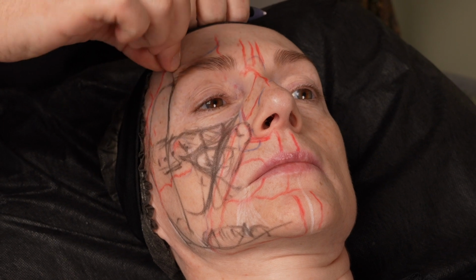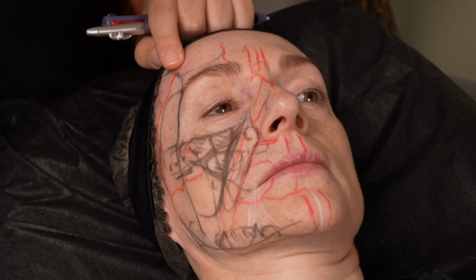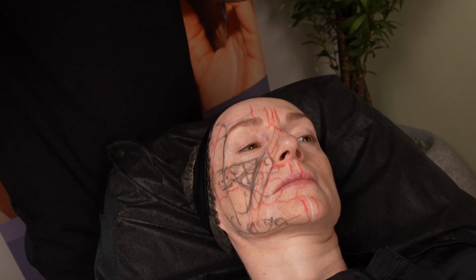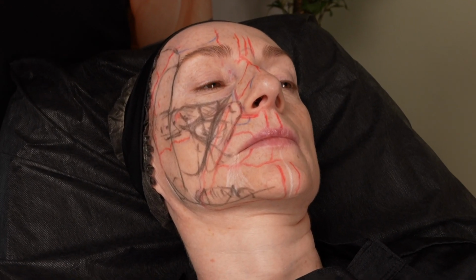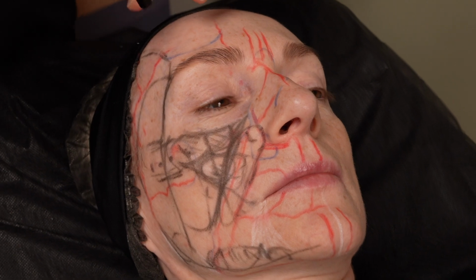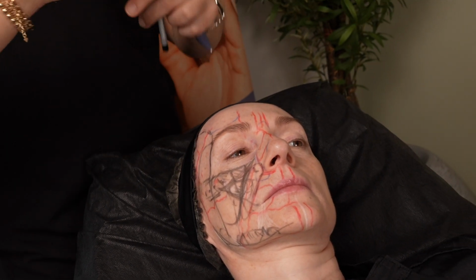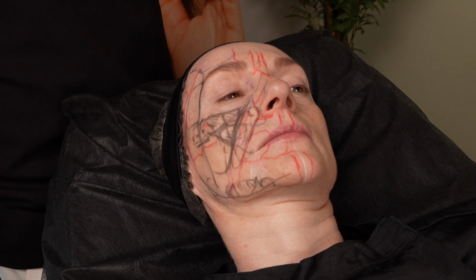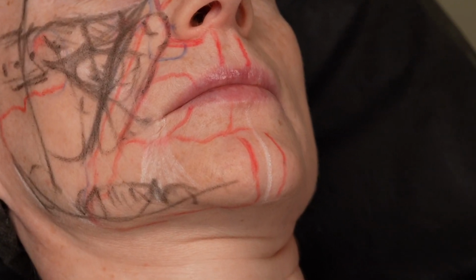If in the crest area I open with my guide needle until the bone, until the galea, then I put my cannula until the galea, then I slide to the temple area. I open, touch the bone, then I slide to the temple area, I'm over the galea, then my cannula is directly over the deep fascia. It means interfascial layer. Okay, this is easier.